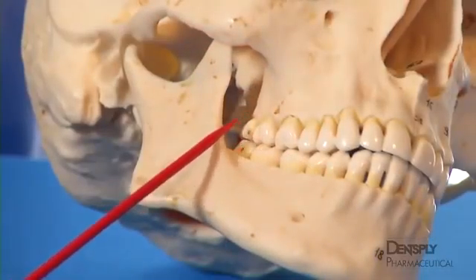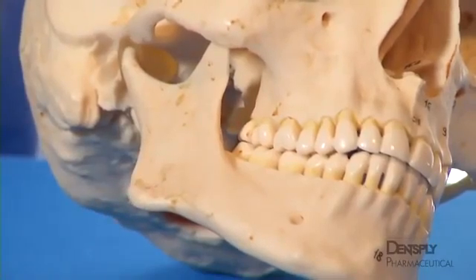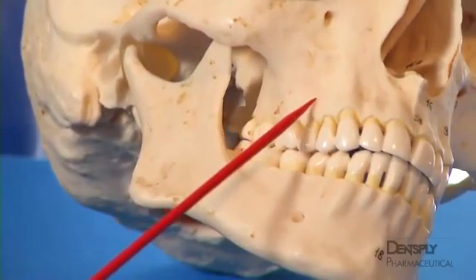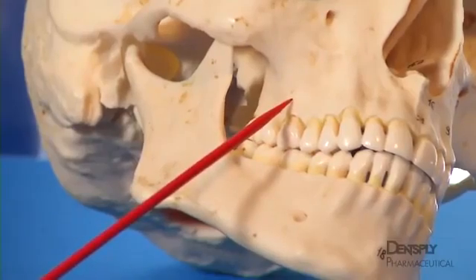The posterior superior alveolar nerve block is used to produce anesthesia of the posterior maxilla. Usually all three maxillary molars are anesthetized, along with the surrounding periodontium and maxillary buccal mucosa. However, a separate supraperiosteal injection over the maxillary second premolar or mesiobuccal root of the first molar may be required to ensure complete anesthesia of the first molar. This injection is generally referred to as the middle superior alveolar and will be discussed later in this program.